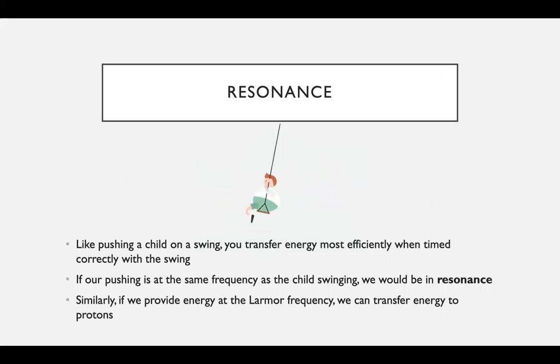So if you've ever pushed a kid on a swing, you'll know that you transfer energy best when you're pushing at the same frequency as the child and at the correct position. You don't want to push when they're coming back to you. You want to push when they're going away from you.